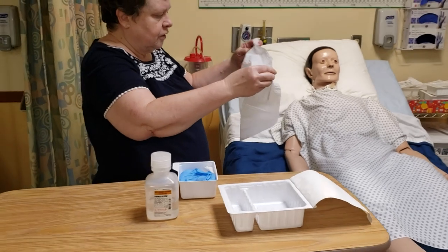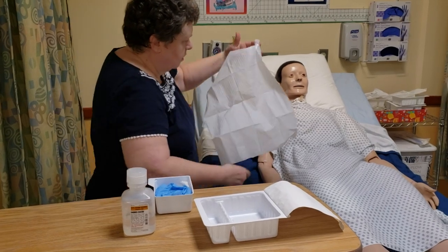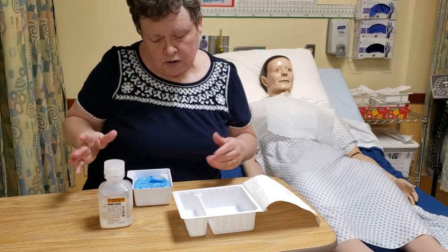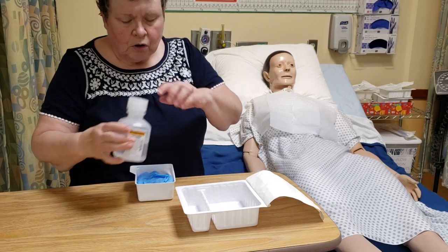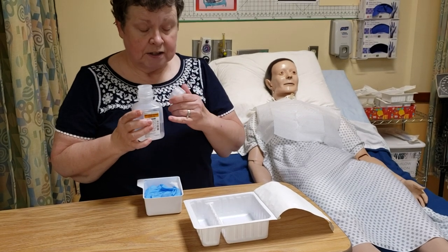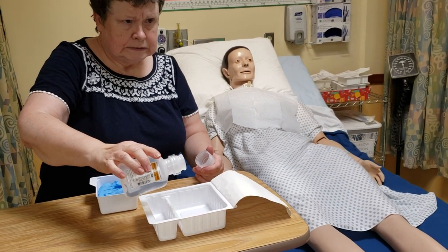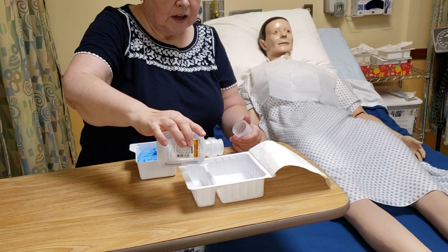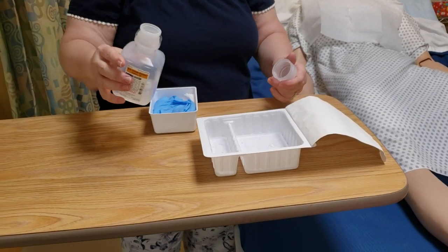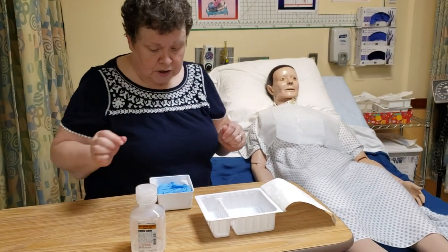You can take your little drape out — it's kind of like when you have your Foley catheter drape, it's just there to protect the area. Touch it as little as you can. Put it on the patient or use it as your sterile area on your table. Go ahead and pour your solution — sterile saline or sterile water per your facility policy — into your washing and rinsing areas. Try to get that done before you put your gloves on, or you'll need a friend to come help you.